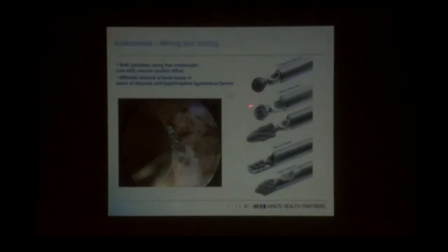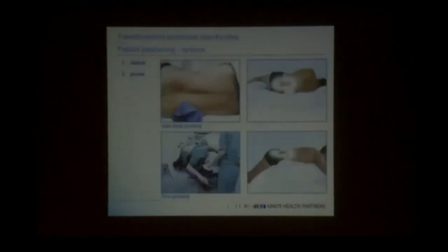Another thing, as I said, is we can use the drill. When you are in and you are not confident, you have done enough foraminotomy and you want to extend, the drills are now available. You can remove more facet to improve the diameter of the Kambin's triangle, and then you can work very nicely with the help of these.